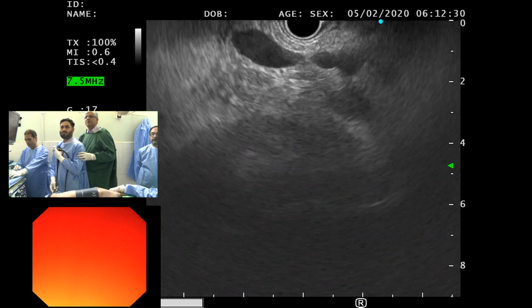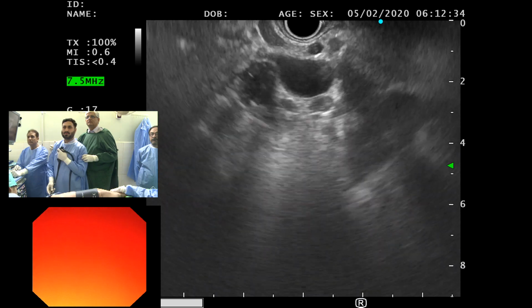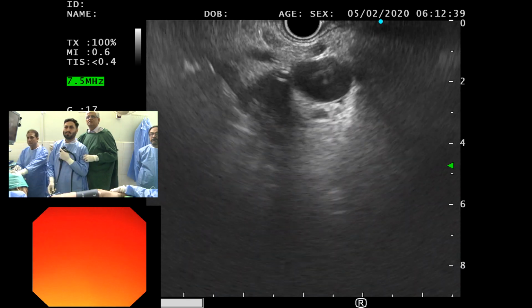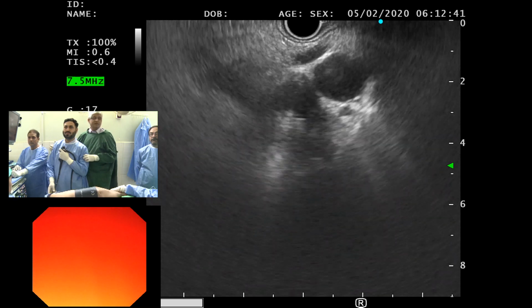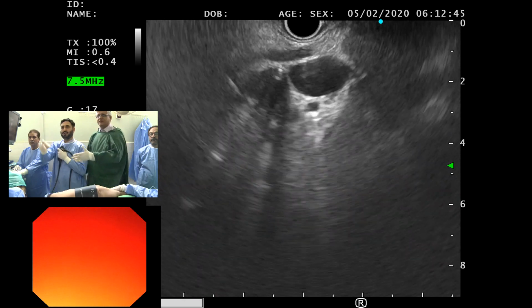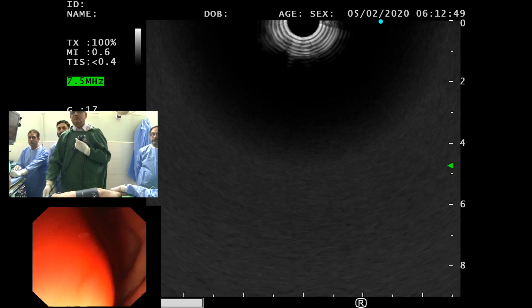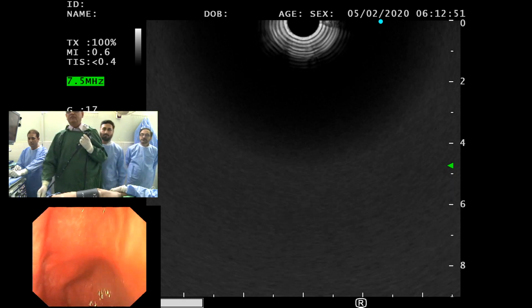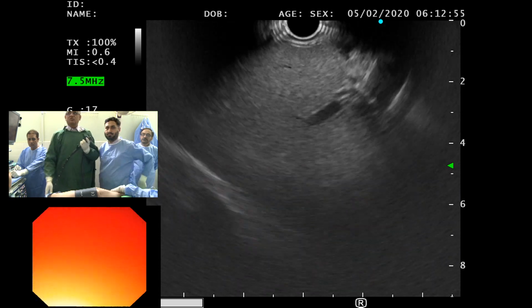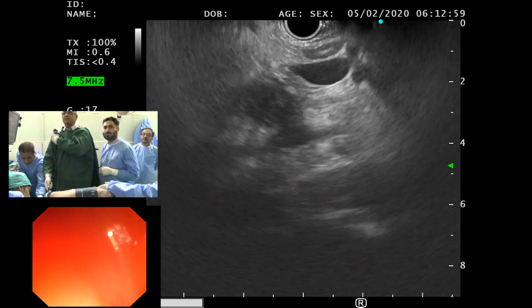We're already seeing something there, but we want to find aorta, right? There are some lymph nodes there that look very suspicious. You can see the CBD and the stent here, right? Give me a second and I will show you what you need to do. So go in. Tip is up. Almost.